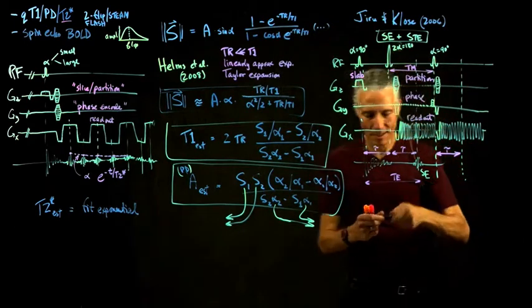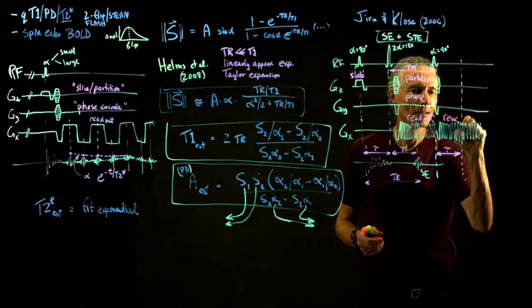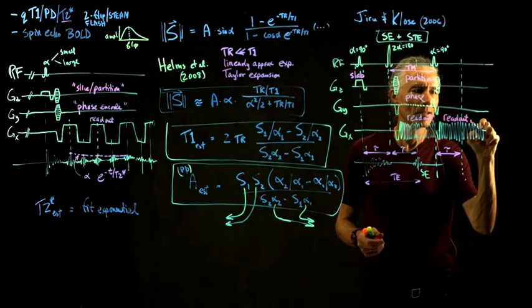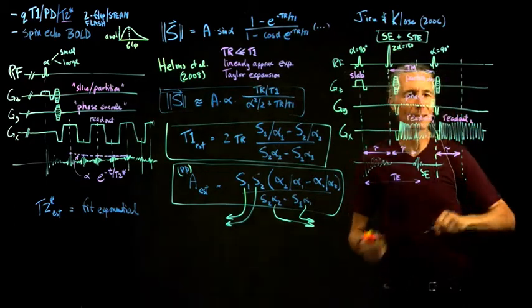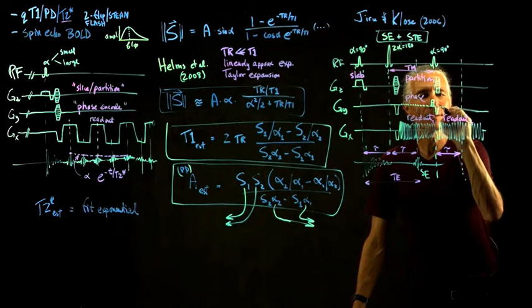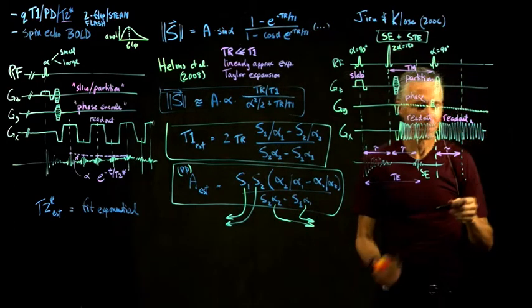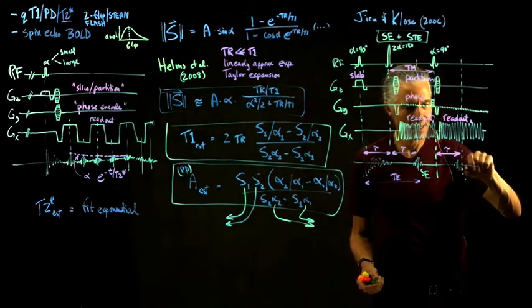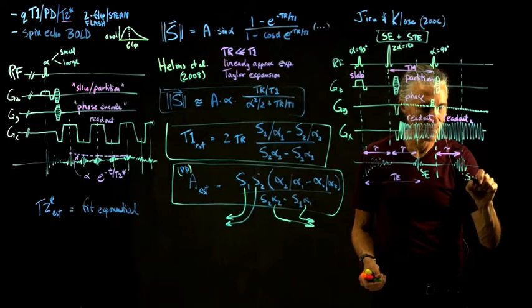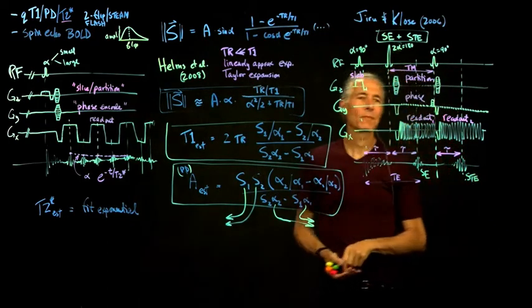So this guy's readout 1, and then we have readout 2 from the same preparation of spins, and then we've got more blips. So here's our little blips. And so then this guy will be another echo. This guy is a stimulated echo with a different equation for it.